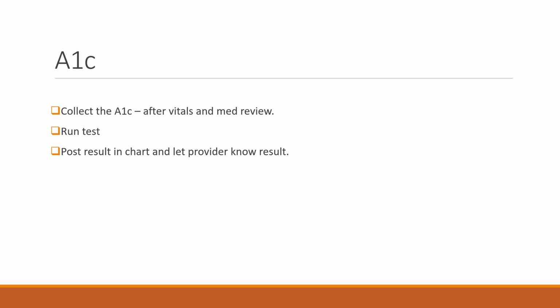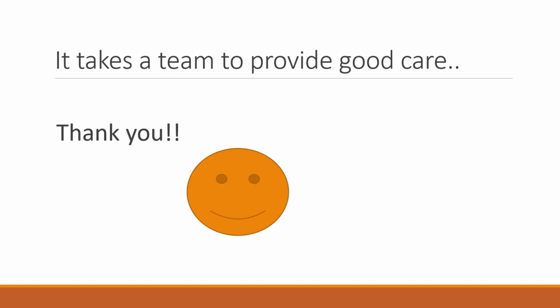The A1C test is a test that you're going to collect after you've already checked vitals and done the med review. You're going to run the test, and then you will post the results in the chart and let the provider know the result. And that's it.